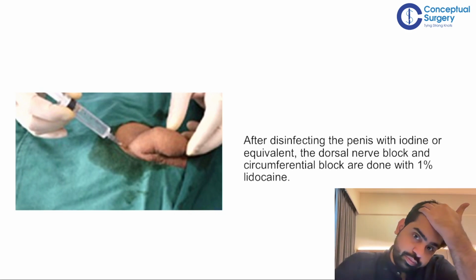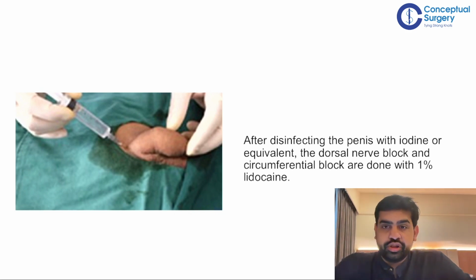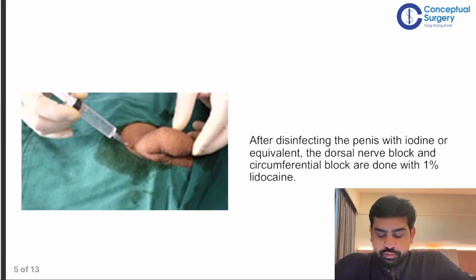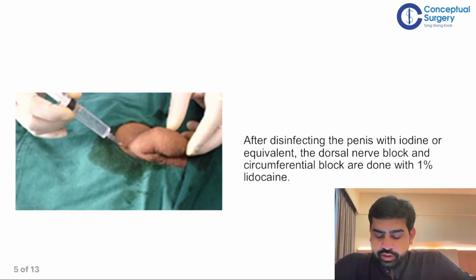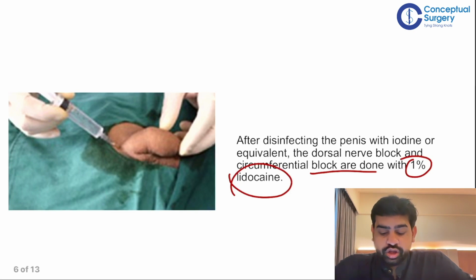But most of the time, people prefer to do it under spinal or some kind of general anesthesia. Please try to understand this. After disinfecting the penis with the iodine or equivalent, the dorsal nerve block and the circumferential block are done with 1% lidocaine. Nothing specific about this. That is the way you give the penile block. Understood, right? So it can be done under local anesthesia as well.